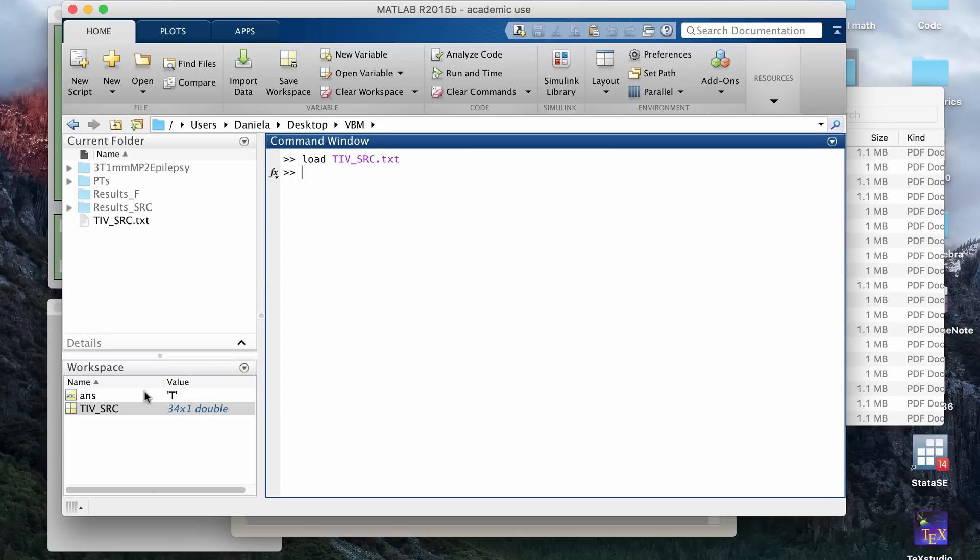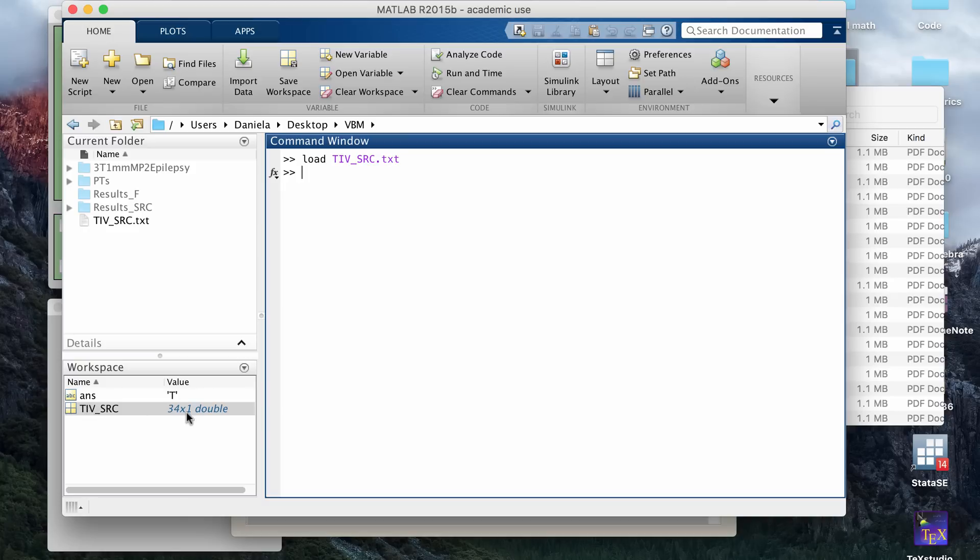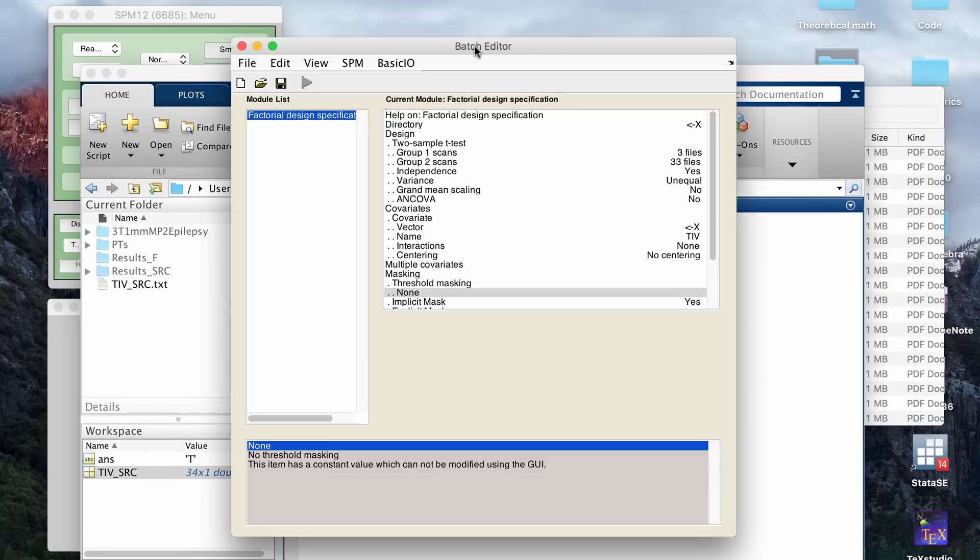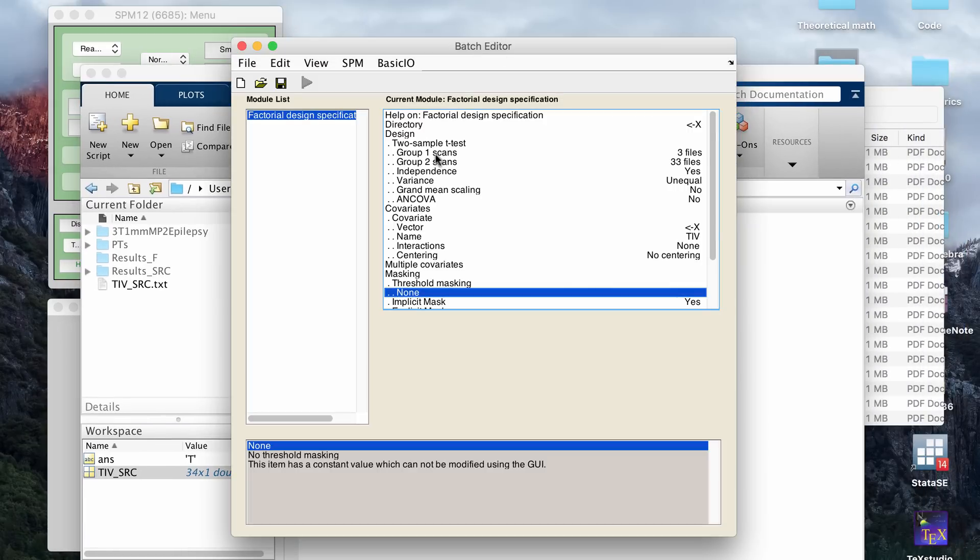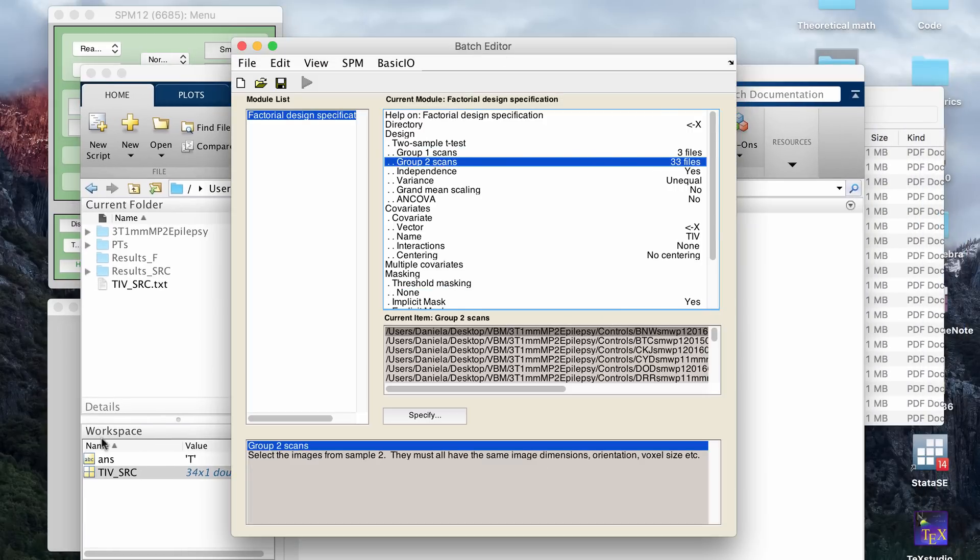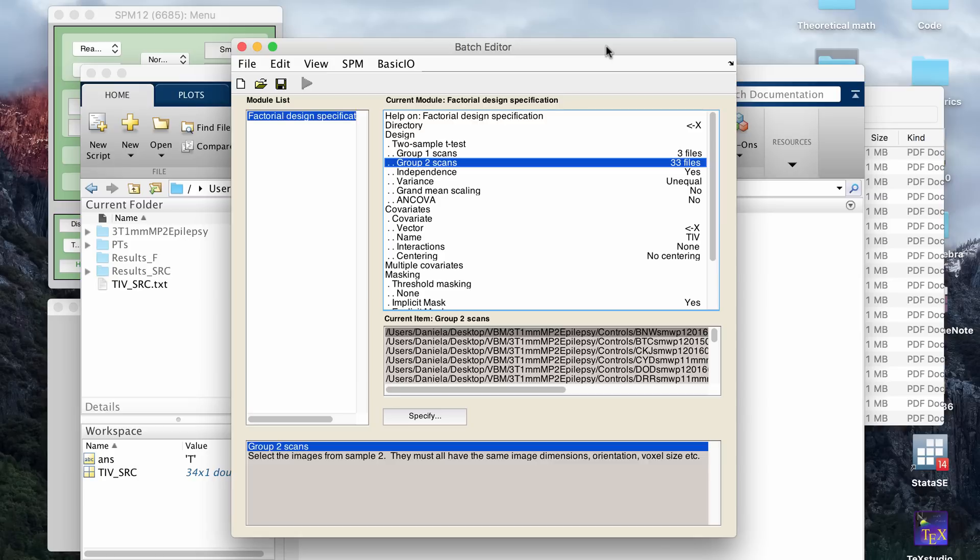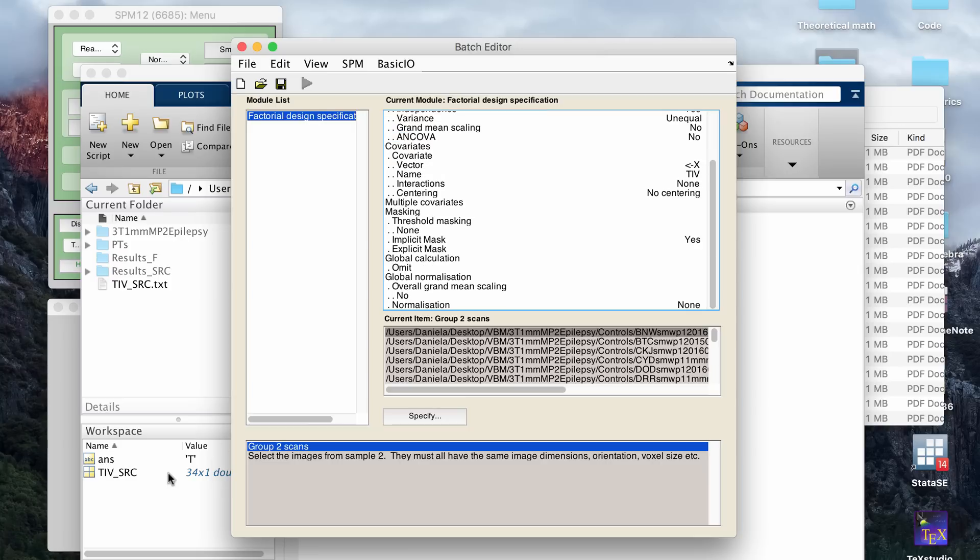And I've already done that, but once you click enter, if you go to the workspace window, it should show you that you have a vector and it will give you the dimensions of the vector. So mine is 34 by 1. And I always just like to double check that when I type in the number of files I have here, that this number equals the number that I have here. So for example, here I have a 36 and I have a 34 here. So that would mean that I'm missing two files from my covariate list. So you just want to make sure the numbers match up or else you're not going to have a correct covariance between the files and the total intracranial volume.